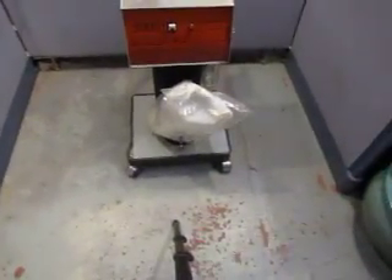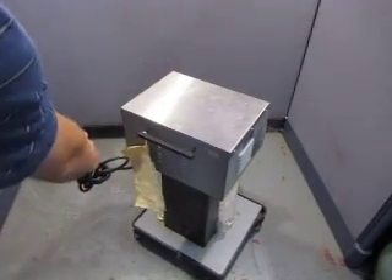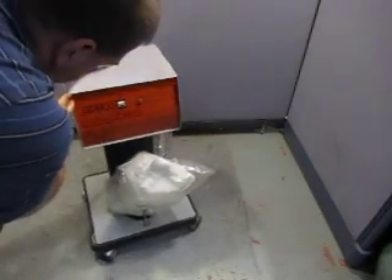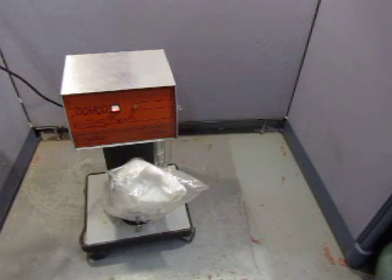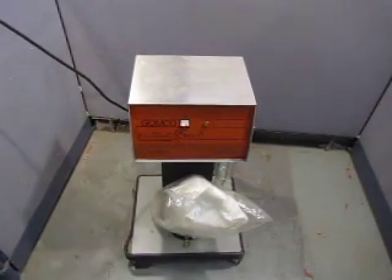I'm going to plug it in and we'll see if it actually works or not. I have no idea right now. So it has a medical grade cord on it. Let's see. Okay, turns out that pump cycles and it's working. Can you hear that? That's what it does. I don't know if that means it's totally working or not, but that is what the unit does.